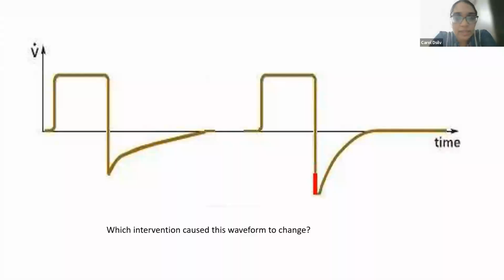Okay, so this is a flow time scalar, and this is a flow control. You can see, right? The flow is remaining constant. And remember that expiration is always passive. So you cannot have a constant flow there. Okay, so what is happening in the first part of the scalar, the left half?